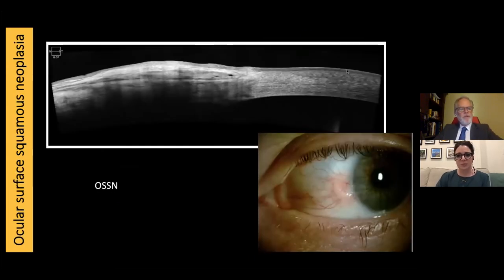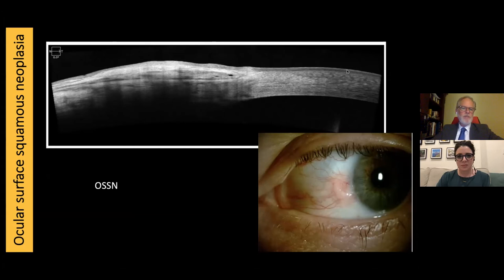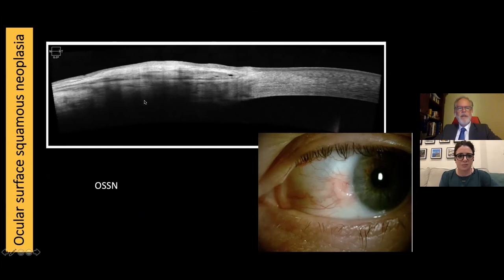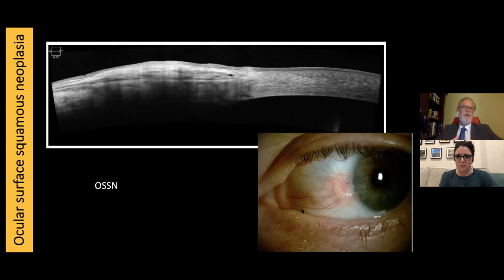This is a case of ocular surface squamous neoplasia, or OSSN. I practice in Maine on the coast and we actually see about one a month in our practice. The anterior segment OCT is the perfect tool for this — you can photograph it, but without stereo you really can't get the depth or see how thick that conjunctival epithelium is. With OCT you can really see this well.